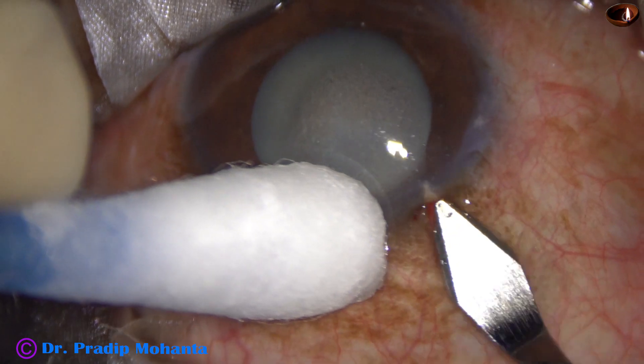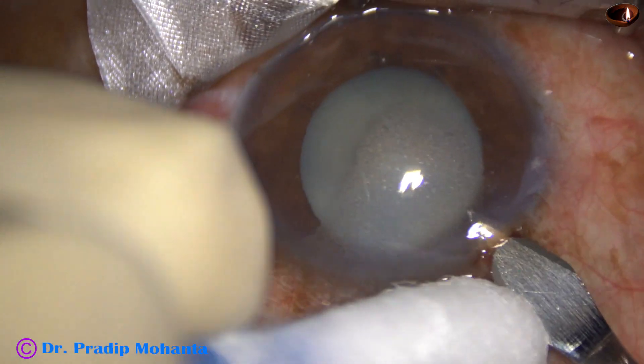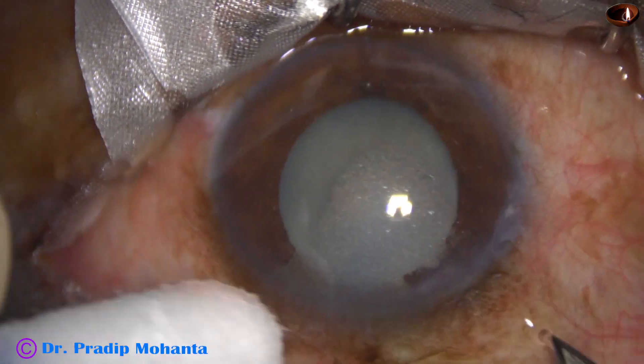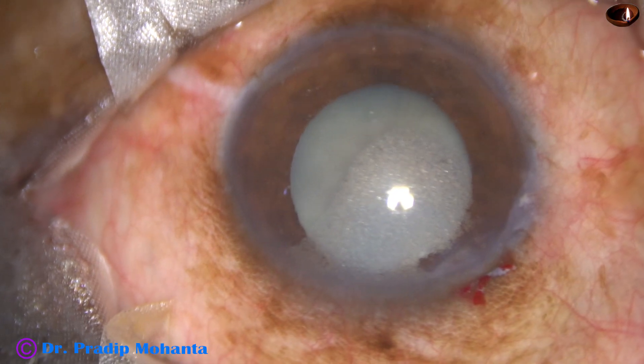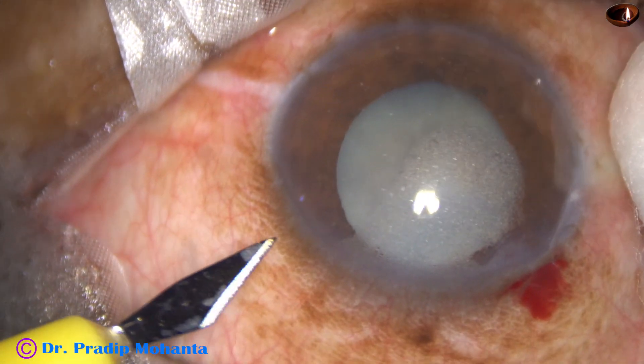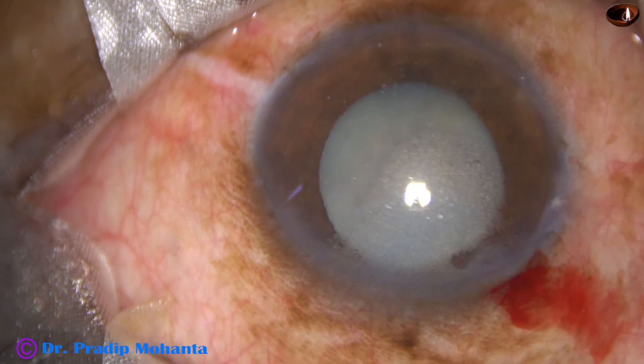This is the main incision with a 2.8 millimeter steel keratome on the posterior aspect of the limbus. This is a triplanar incision. And now a side port is made on the left side of the main incision, about 3 o'clock hours away.